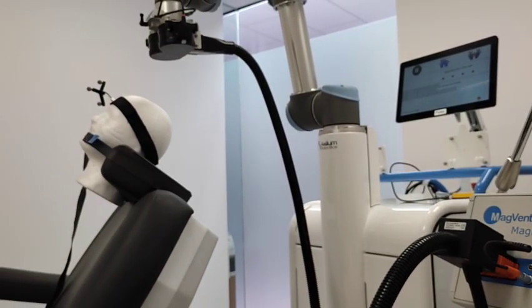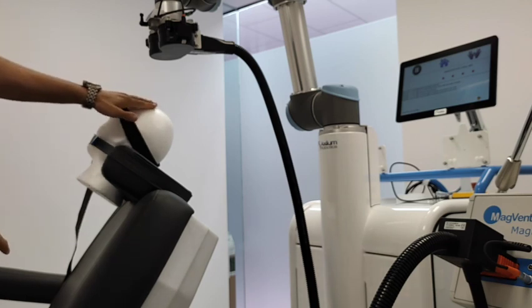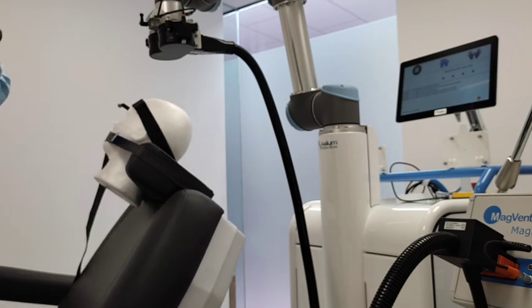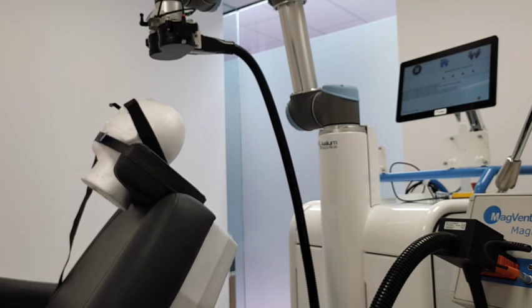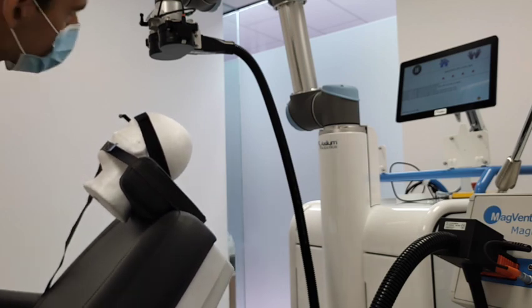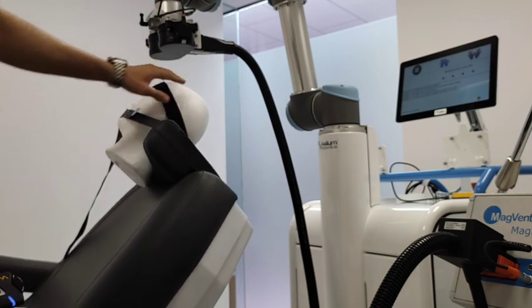From this point, it is important to set the patient exactly underneath the parking position. So we want to put this side underneath the coil, and a distance between 5 and 10 centimeters between the coil and the target.